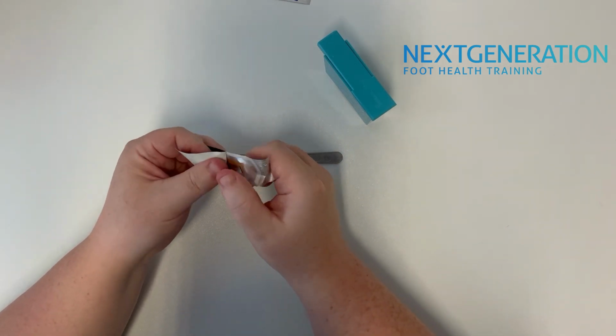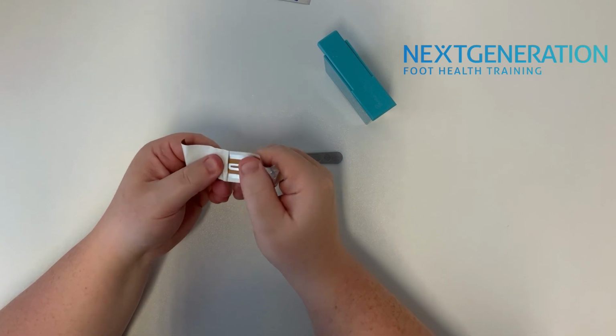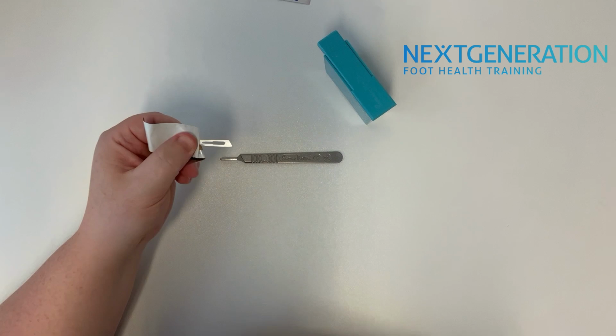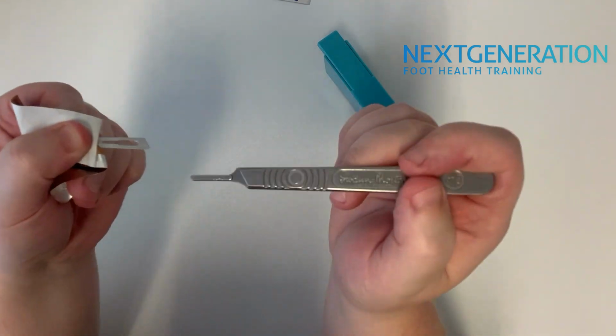So if you struggle at any point to put a blade on, you need to stop and just have a little think as to where you might be going wrong. So exposing the hole completely, so the top of the foil packaging and also the underneath of that foil packaging as well. So now we've got the holes exposed for that blade, we then need our handle piece.